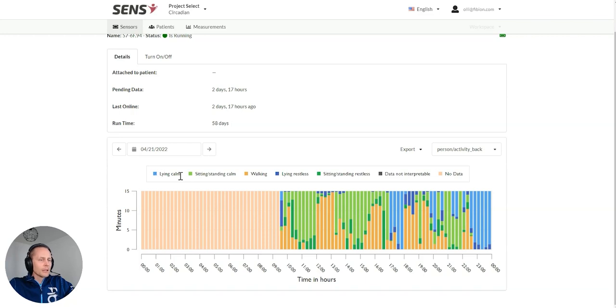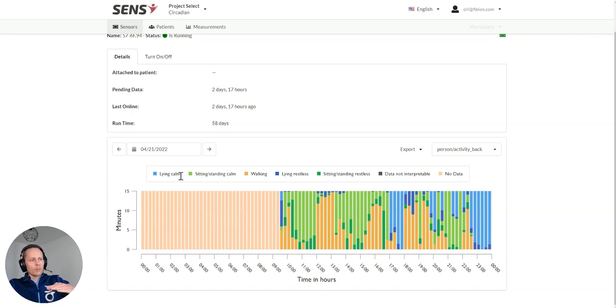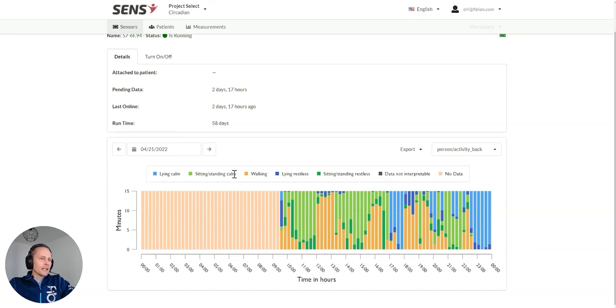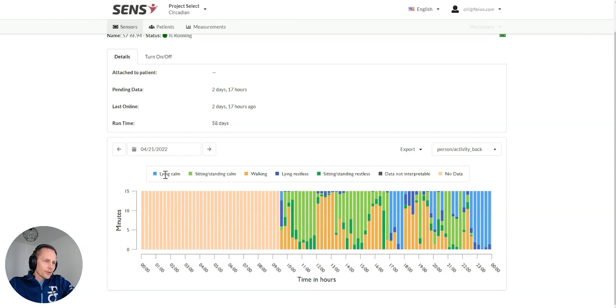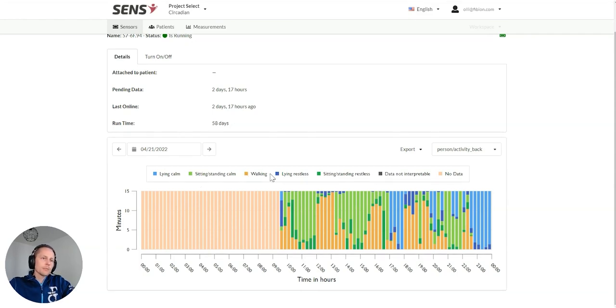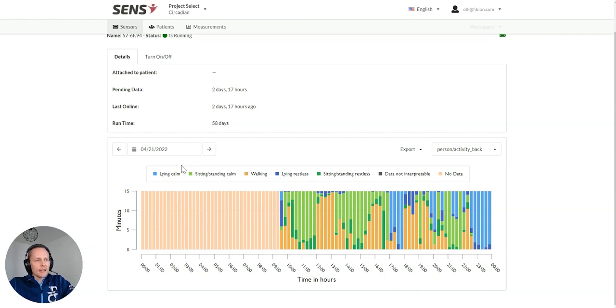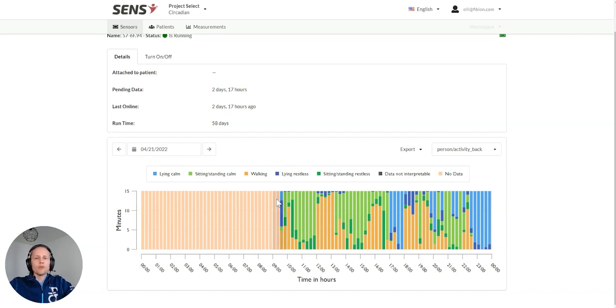We can see that there's no data here until 9:30 in the morning. And then we have different categories of lying calm, so lying down calmly, sitting, standing calm. With this device we can show whether a person is lying down or sitting when it's on the back. We can see when the person is walking.